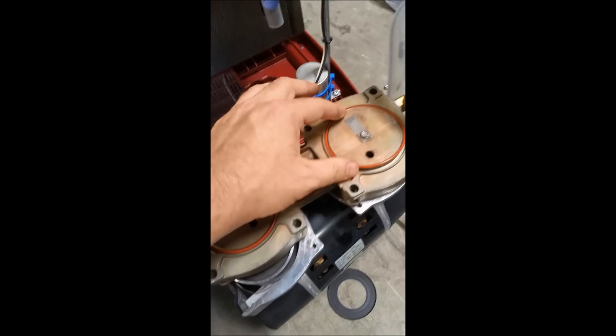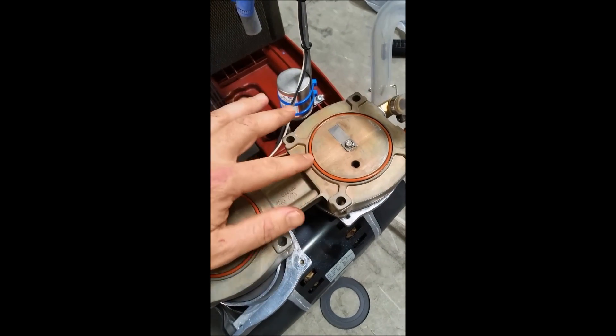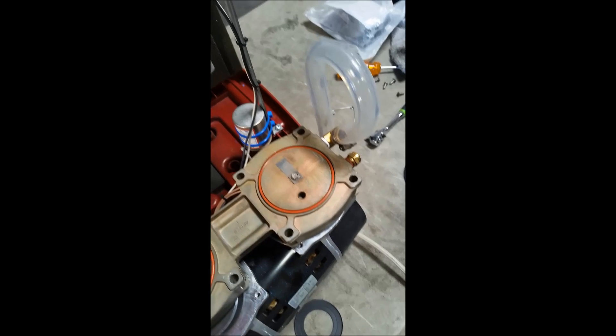Here's what the new seal looks like. We're now placing the next one in — you can see it's pretty simple, fits right on there.